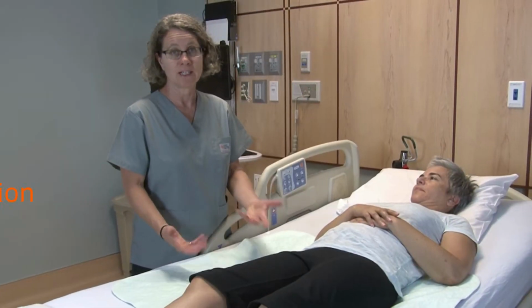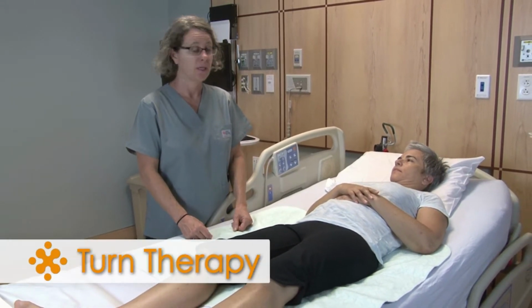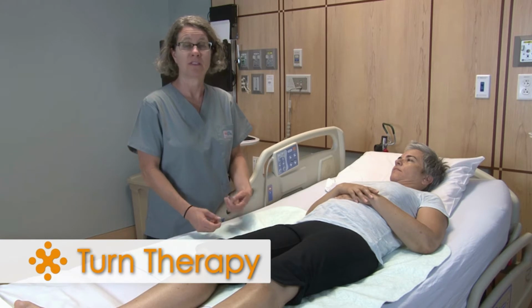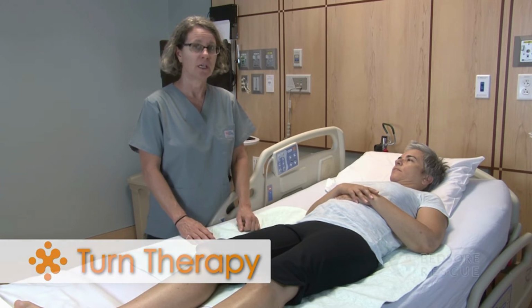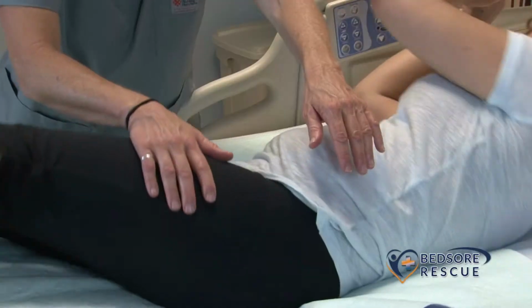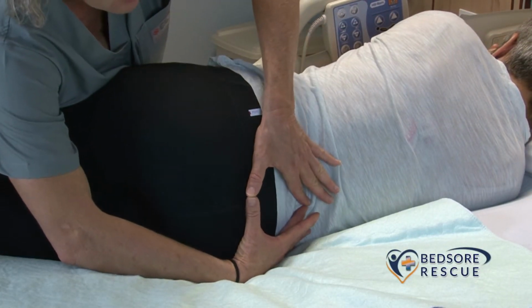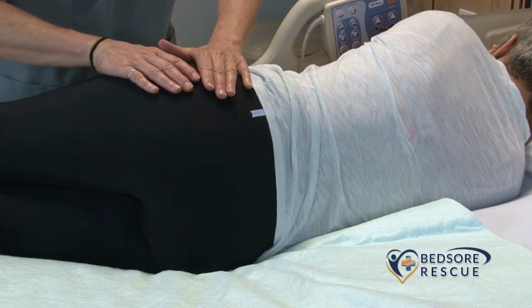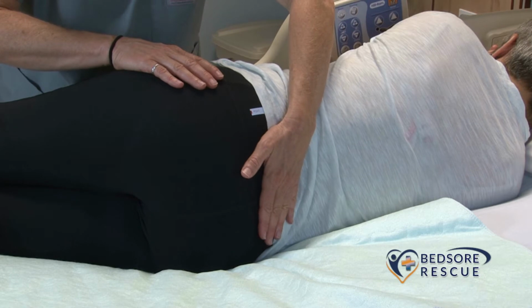As you probably know, an essential part of good nursing care is to do what I like to call turn therapy. Turn therapy means that when a person is unable to easily move by themselves, they need to be assisted to move, to turn at approximately a 30-degree angle. That angle, 30 degrees, is far enough to get pressure off the sacrum and coccyx area, but not so far as to put pressure on the hip, otherwise known as the greater trochanter.